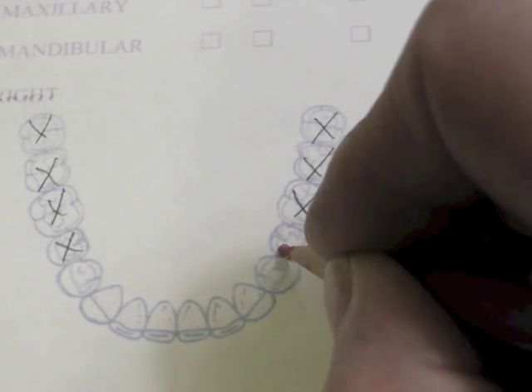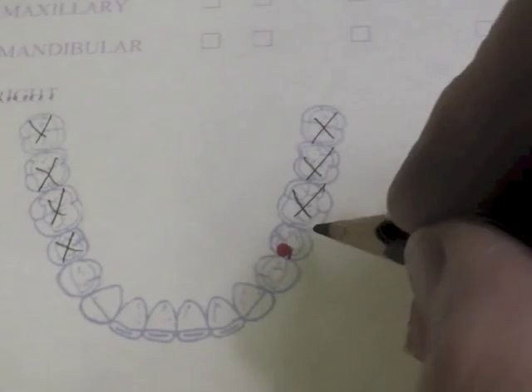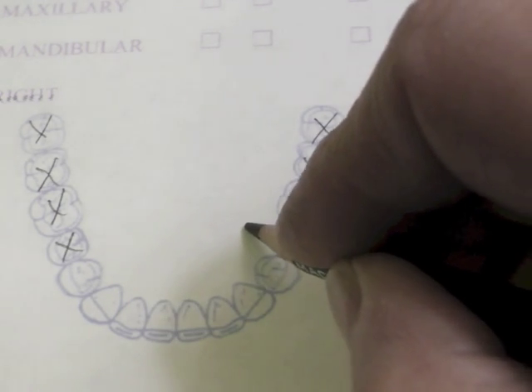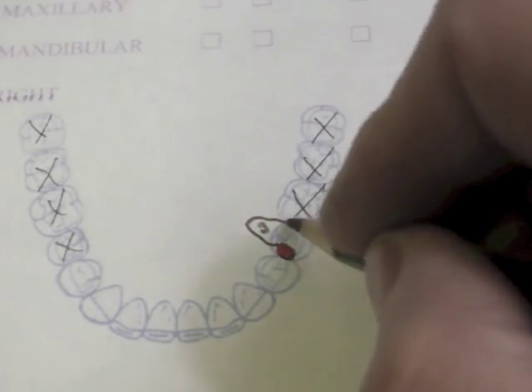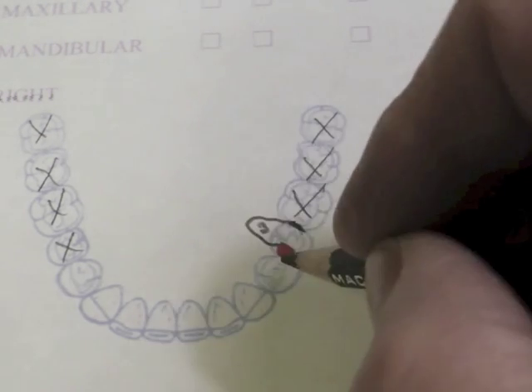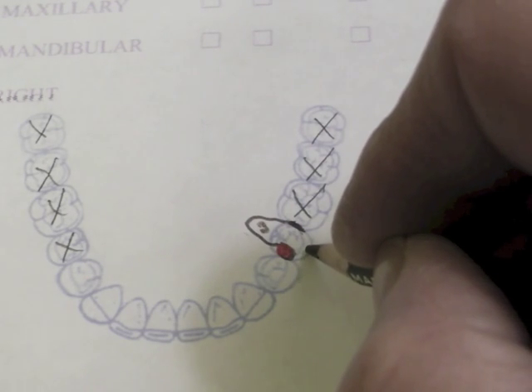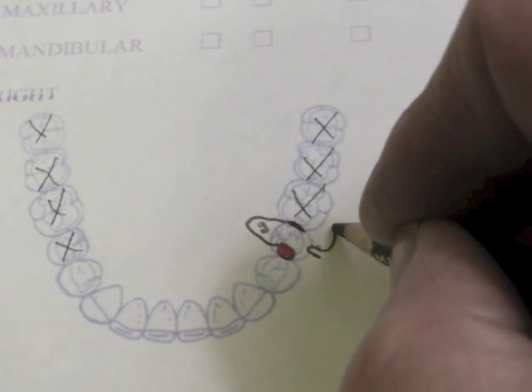I would have a mesial rest and a distal guide plate. I'm going to dip down, void the marginal gingiva by at least three millimeters, and my guide plate will wrap around the portion of the tooth where it becomes a little bit smaller. The combination of this minor connector and this guide plate are actually going to keep the tooth from moving to the lingual when this I-bar flexes into a 0.01 undercut.